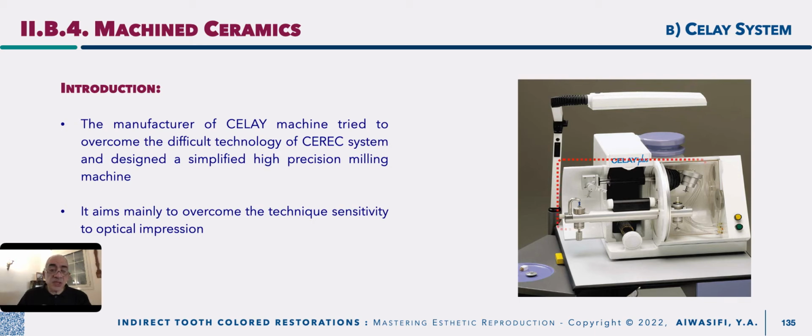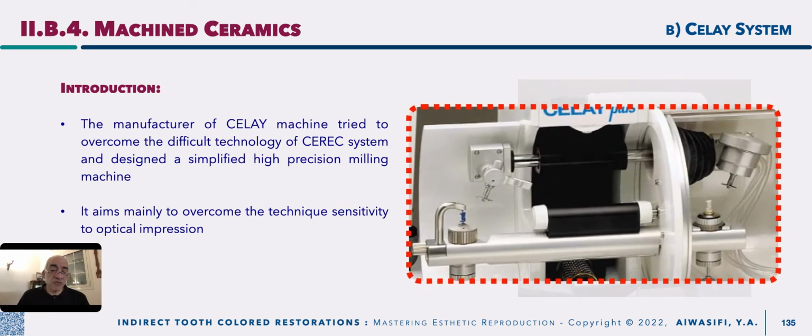For the CELAY system it is similar to that idea. If you notice, you have this blue one to the left, which is what is called pro inlay, and it is similar to a wax pattern, where the tracer is passing along it, tracing all the dimensions and all the details of the fitting surface and of the anatomical form of your tooth, whereas on the other side, which is fixed on the same table, there is a block of porcelain, where also on the same spindle of the tracer there is a cutting drill which will cut the same feature that is traced at the same moment.